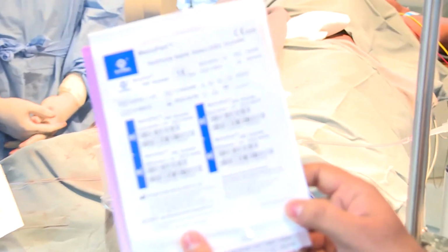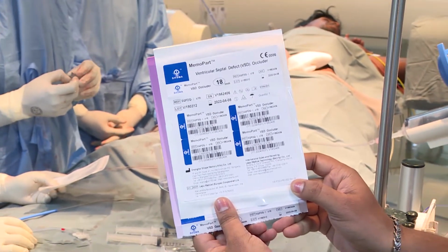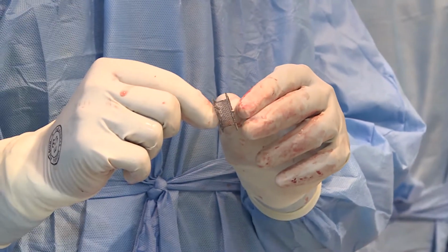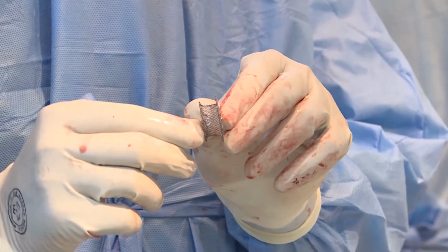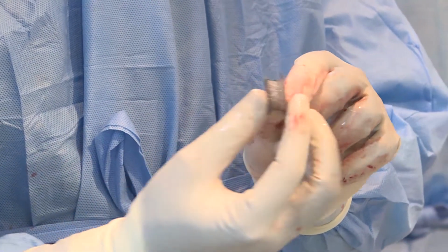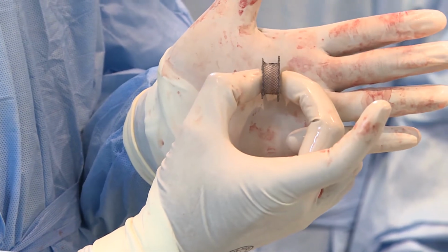So this is Lepu Medical. It is one of the Chinese companies, and they make a device called the MemoPart device. The advantage of this particular device is that there is a lot of customization. Now come to the device. This is an 18 millimeter device, however there are two discs on either side. Since in this case our aortic pressure is higher and the PA pressure is lower, the aortic disc is marginally bigger than the PA disc. I'll try to show you. Yeah, we see it.